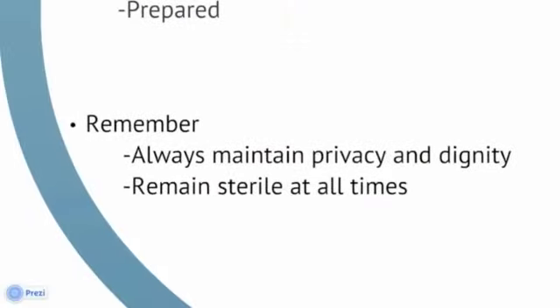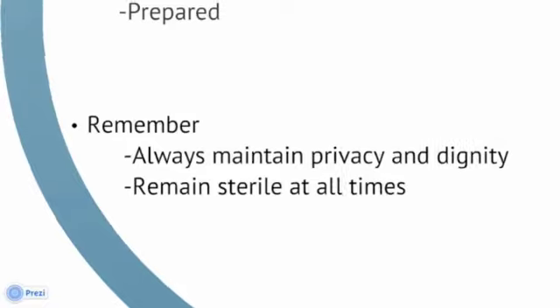Remember, always maintain privacy and dignity of the patient throughout this procedure. There are a large number of steps involved in catheterization. However, you should concentrate on remembering that the aim is to remain sterile at all times to reduce the risk of infection to the patient.